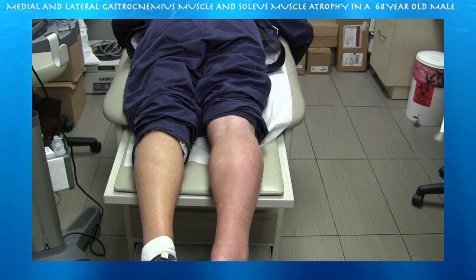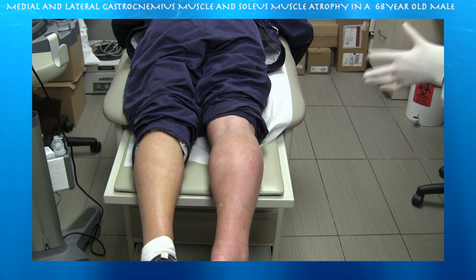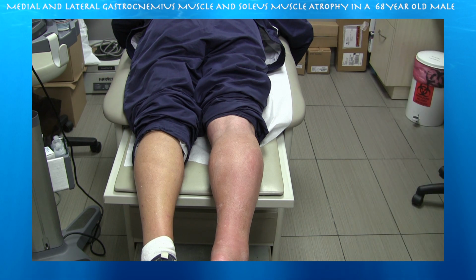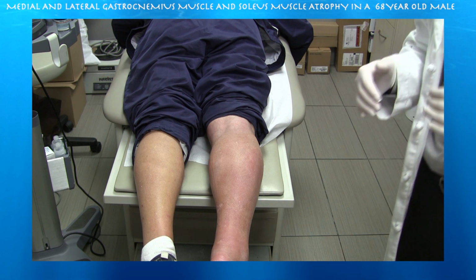He's had all kinds of ultrasounds. One ultrasound did show a clot in the posterior tibial vein, but then he had repeat studies done which showed no blood clot. One ultrasound suggested a mass in the lateral aspect of the right calf, and then he had an MRI which didn't show that. So we got all these kinds of mixed studies.